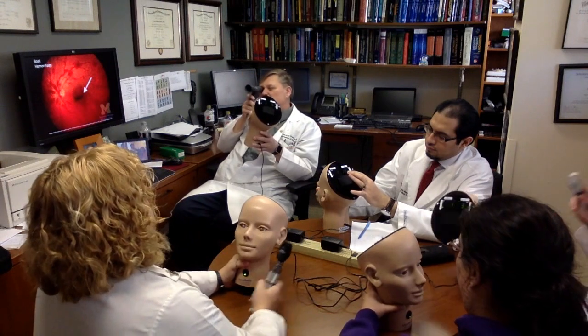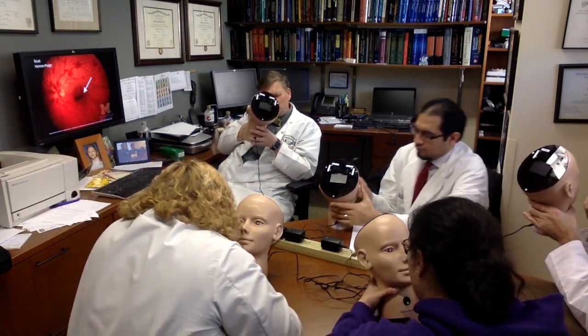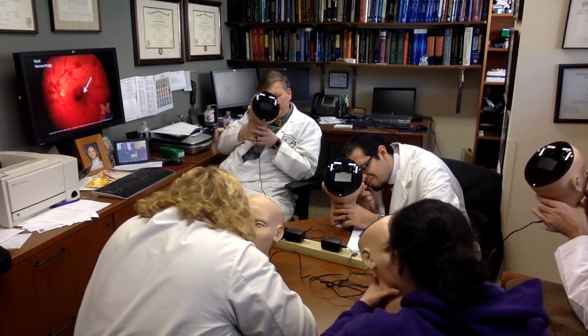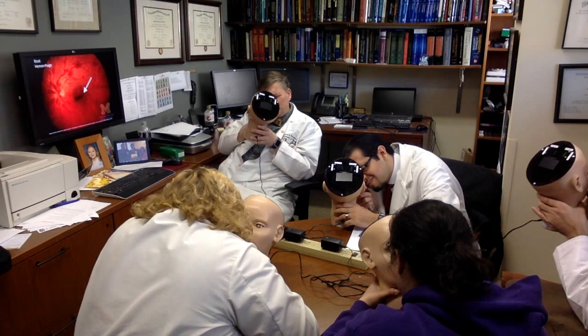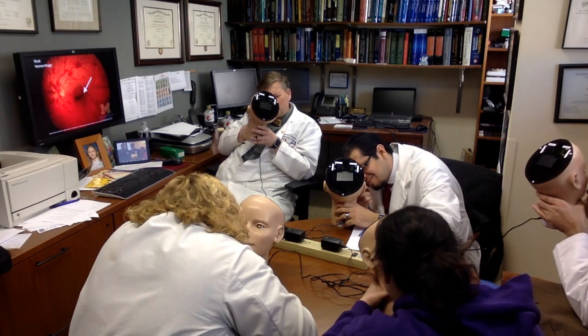Focus in at a distance, about 10 feet away. Come in at 15 degrees, come closer. And then when you get closer, you'll get near the disc. Can everyone see the disc? What do you think of the color of the disc?